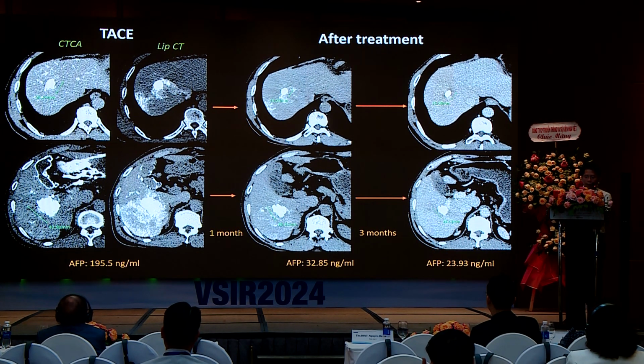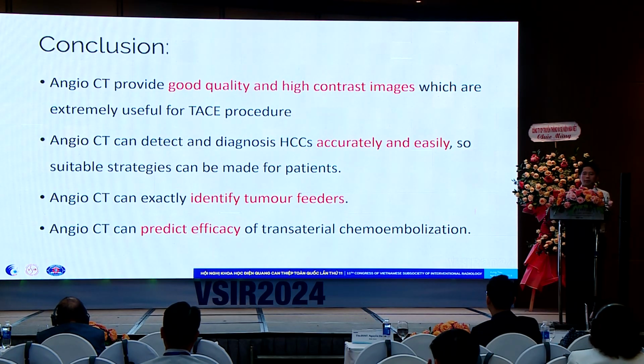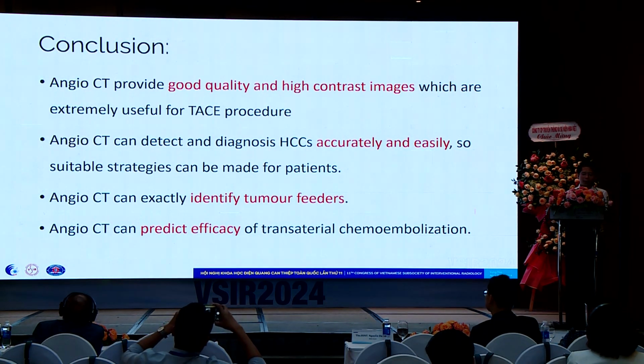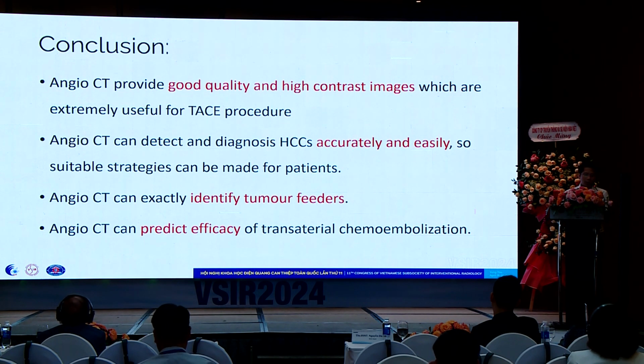AFP level has decreased. So, in conclusion, I want to emphasize that firstly, angio-CT provides good quality and high contrast images, which are extremely useful for TACE procedures. Secondly, angio-CT can detect and diagnose HCC accurately and easily, so suitable strategies can be made.